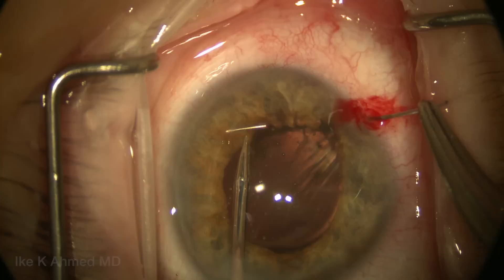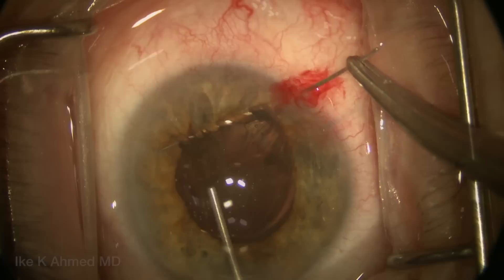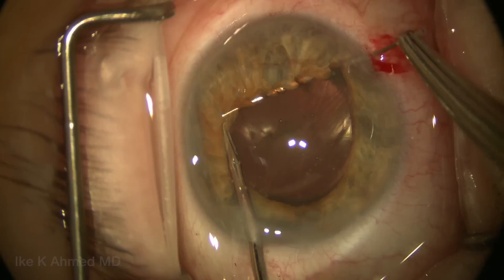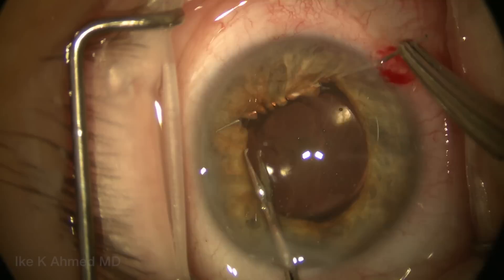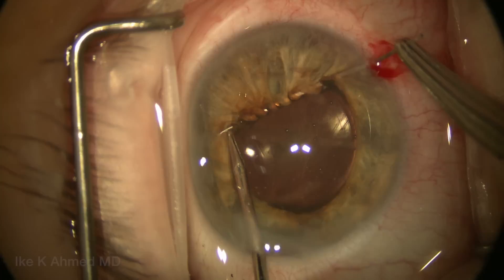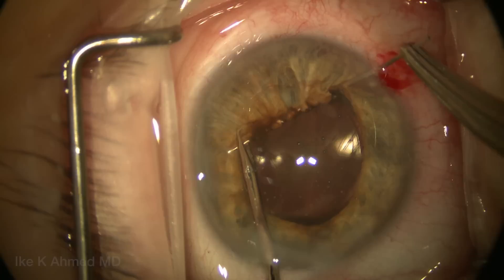Once we've gotten through a significant amount of tissue, we inject a little more viscoelastic to preserve the anterior chamber space and remove some pigment from our view. We continue along, marching toward the superior incision on the left side of our view, grabbing as much tissue as we can comfortably. We've changed the trajectory of the needle heading toward the superior paracentesis, and most of the work is being done by the micro grasper pushing iris tissue along the needle to give more room at the tip.